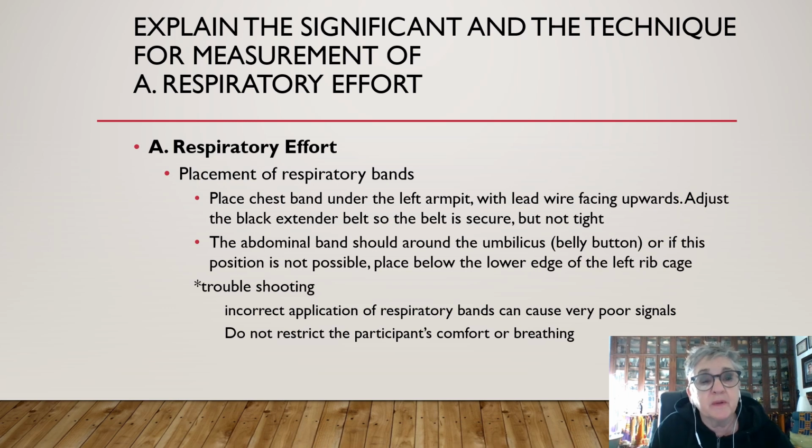Troubleshooting: incorrect application of respiratory bands can cause poor signals, and they should not restrict the patient's comfort or breathing. What's the significance of this? Well, we want to see them breathe in and out. We want to see inspiration, expiration, chest wall movement.